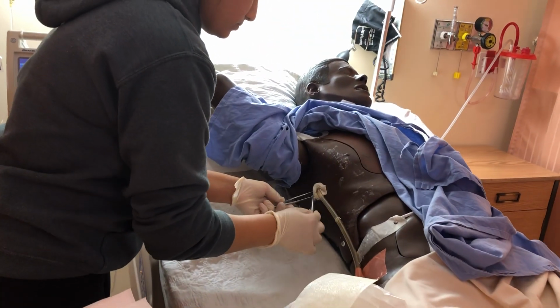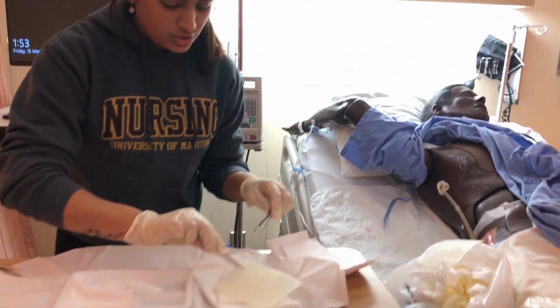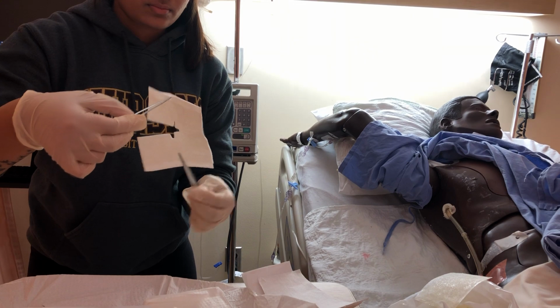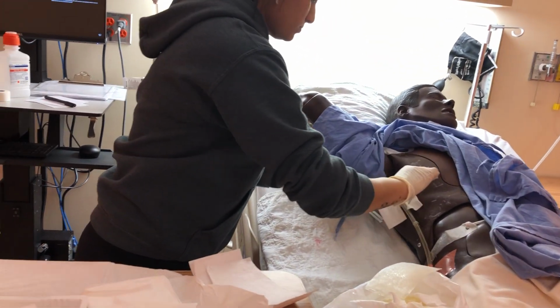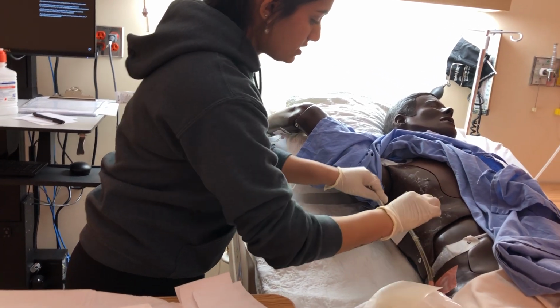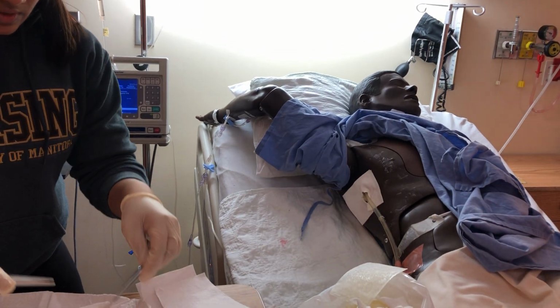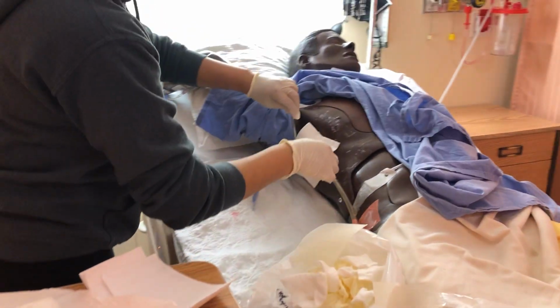My patient bed is going to be down, side rails up. Right, now that it's complete, I'm going to do my 2 drainage sponges. I dropped it on the floor. Oh, that's weird. And it's okay if my forceps touch the site just because I have cleaned it. Let's just place again.